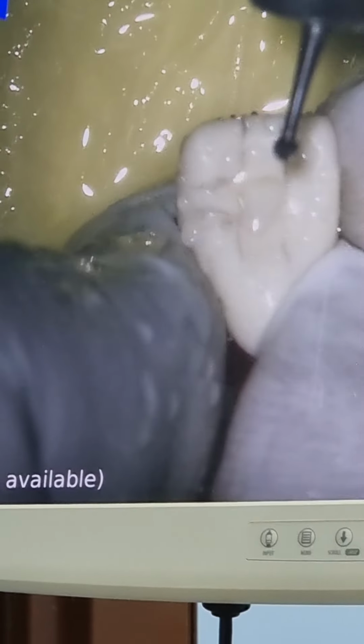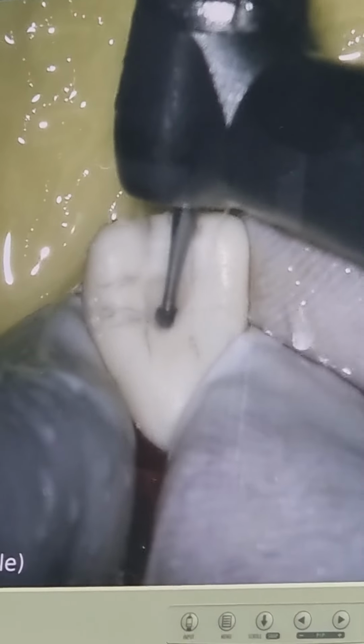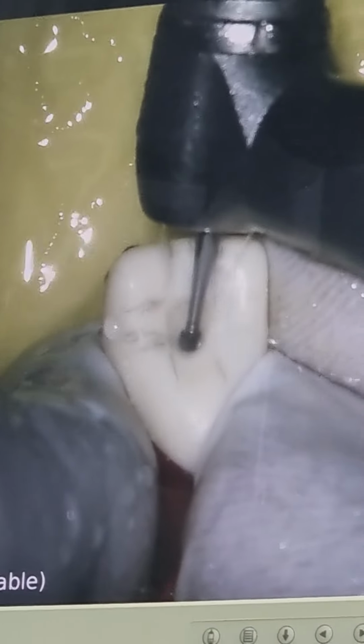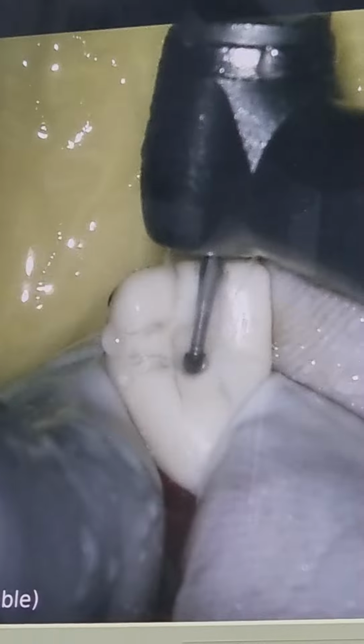You can see the triangle? Yes. Okay, now keep on going a little deeper. From enamel, you go to the dentine, and from dentine, you will reach the pulp.